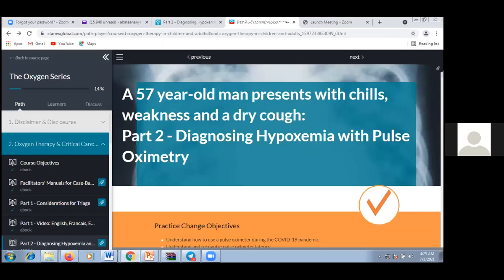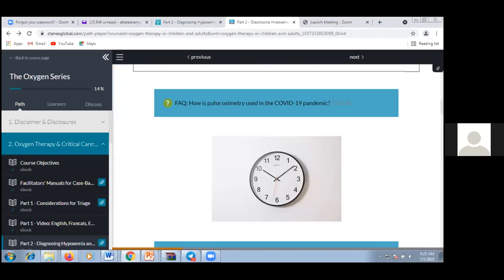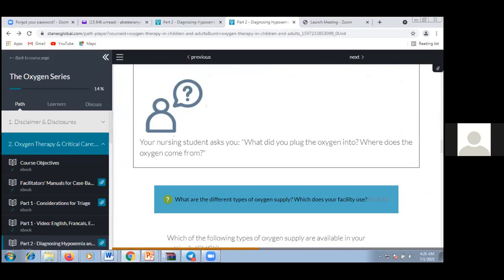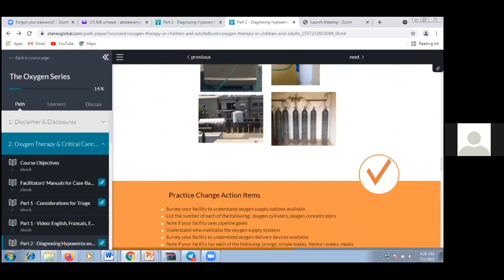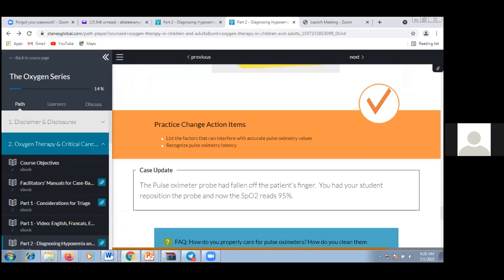Yeah, I think the video is also informative. As Dr. Renatu was saying, you can use alcohol, but be careful not to use too much alcohol and get into the electrical system of the pulsox, which can damage it. The other important thing is you can use any detergents available in the hospital, but it has to be diluted. If you use, let's say, sodium hypochlorite solution, then it has to be diluted to like a 0.1% solution.